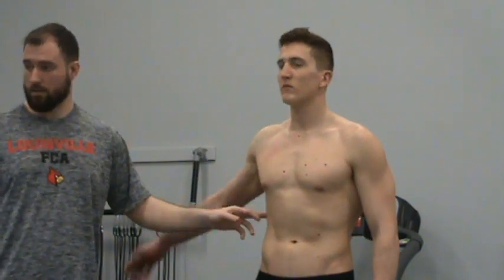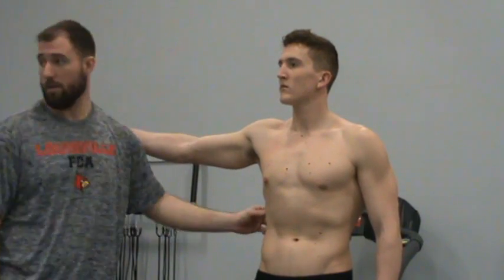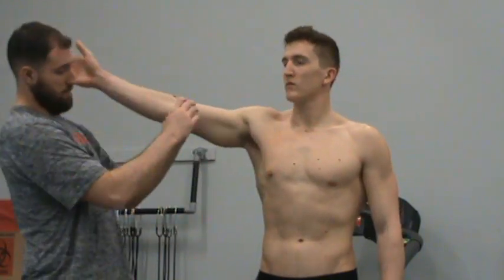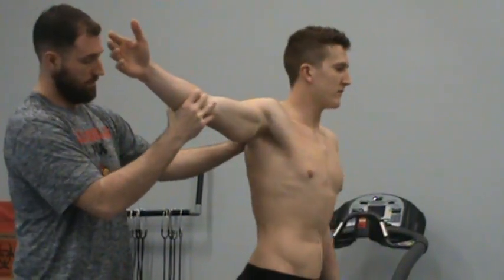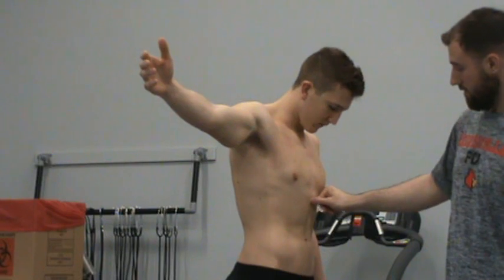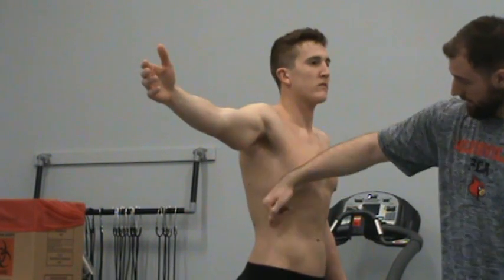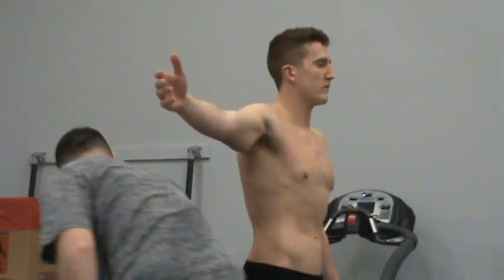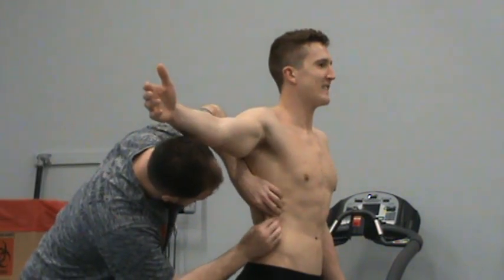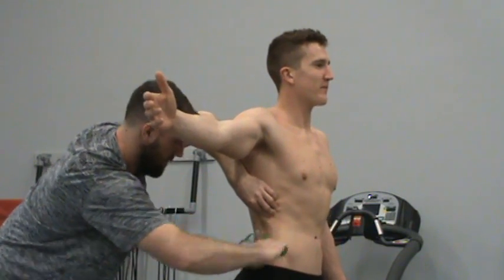Then he turns back around and I'm going to do the mid-axillary. This is going to be right at the level of his xiphoid process, going right about that level, mid-axillary, right under his armpit. Same thing — two hands, getting a good fold, caliper right under my thumb. I got a 12.